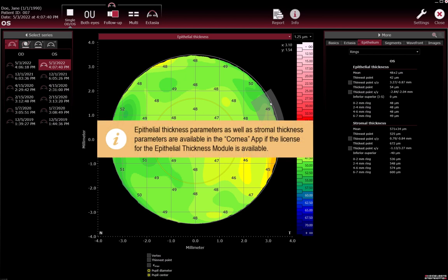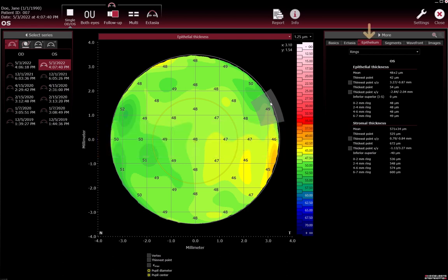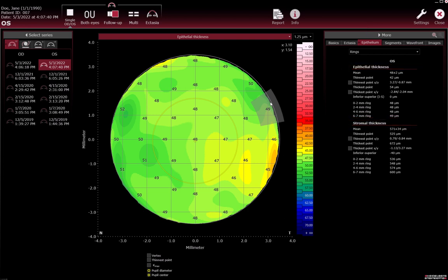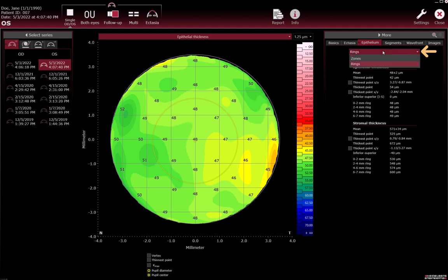Epithelial thickness parameters as well as stromal thickness parameters are available in the Cornea app if the license for the epithelial thickness module is available. In the Epithelium tab, epithelial and stromal parameters are displayed. Select rings or zones from the drop-down list at the top to specify the segment type and to have the corresponding parameters displayed.